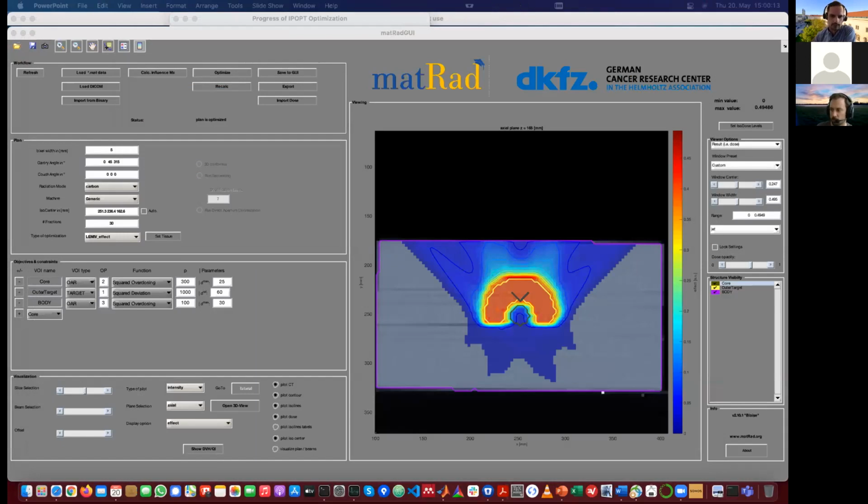before I show you this, I have to say, as Niklas was also saying before, that the current tissue refers to a radiosensitivity in the photon world of an alpha beta ratio of 2. So the alpha x and the beta x are 0.1 and 0.05. These are the reference parameters. This is the reference tissue, so to say, where the radiosensitivity has been quantified in the photon world, but not in the carbon ion world, for which we need the LEM model to do that.